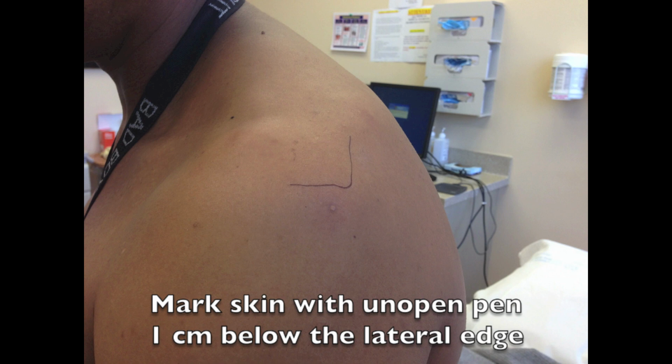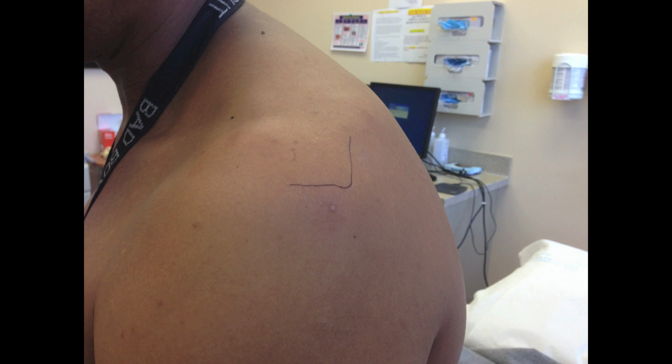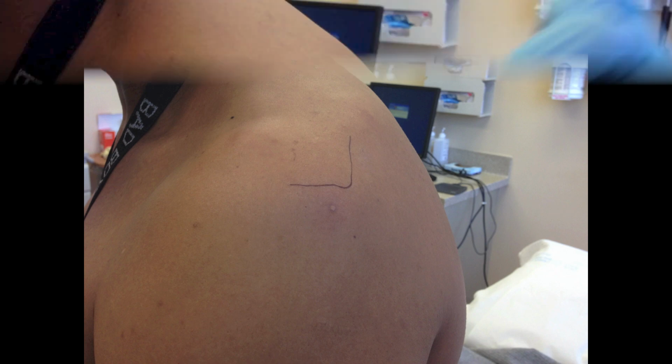It may also be useful to have the patient sit at the edge of the exam table to allow their arm to dangle freely and allow gravity to open up the subacromial space.